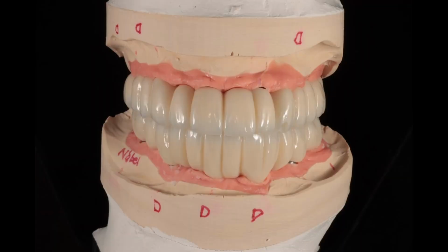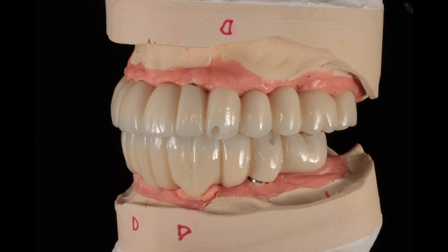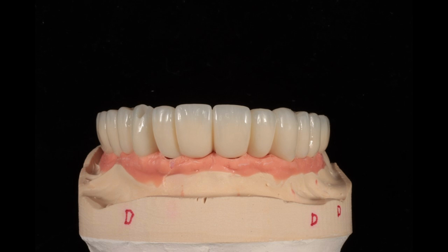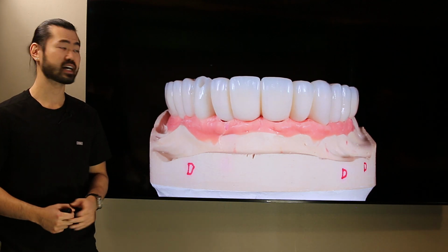With that information, the lab is now able to fabricate definitive prostheses. These prostheses come together and fit very nicely, and the lab is able to produce quite a lot of character, making sure that the teeth have a lot of definition, have a lot of translucency, and they don't look like individual monochromatic blocks.